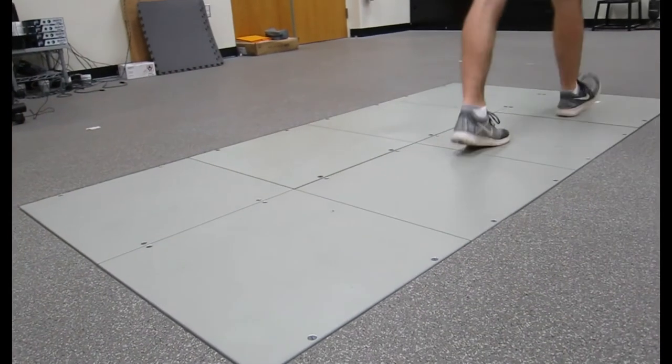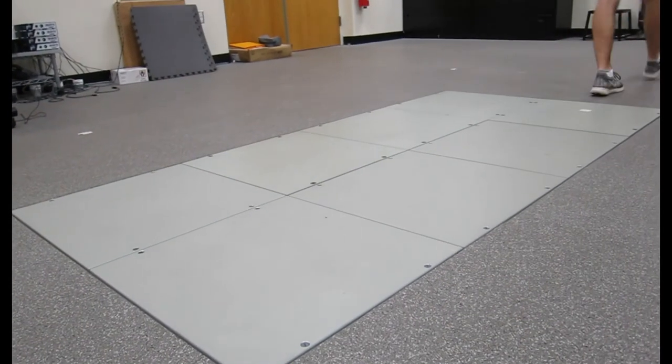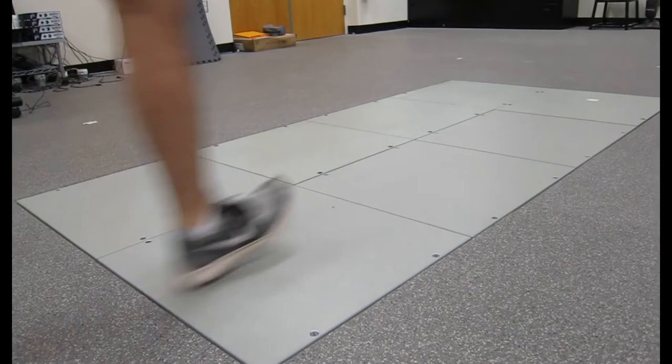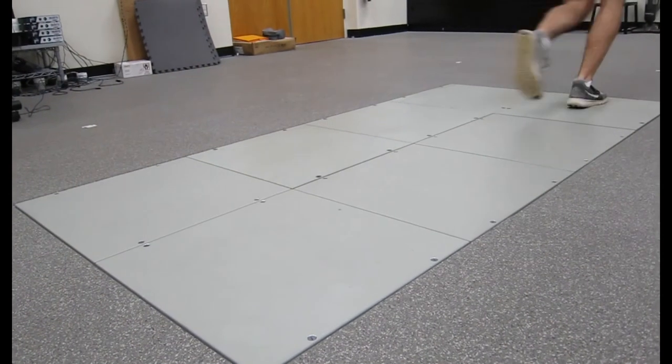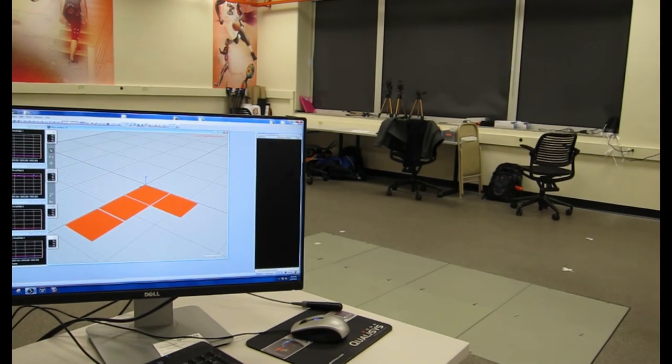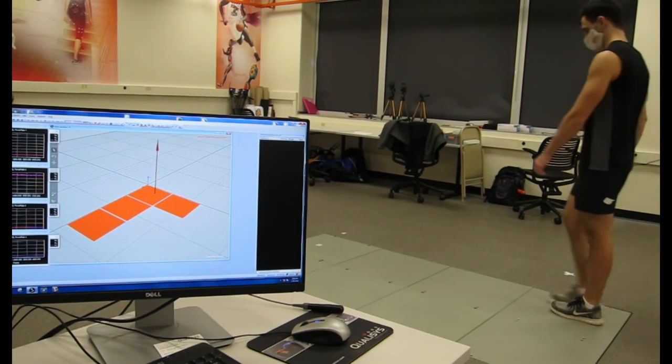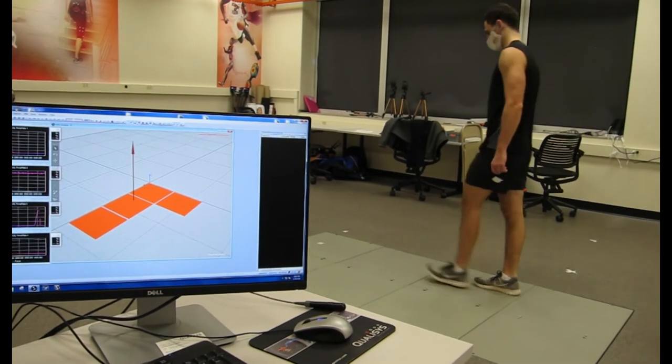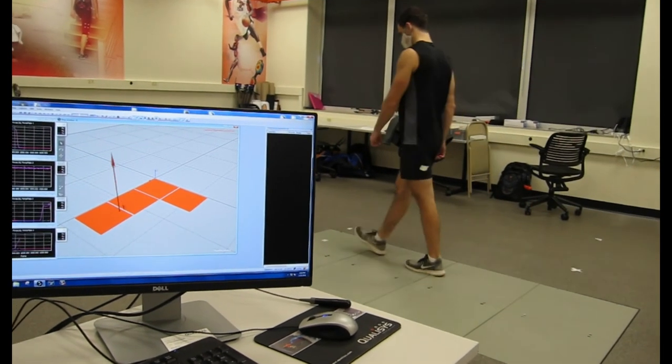If the right and the left have big differences, asymmetries can be identified, possibly related to an injury or as a sign for an injury risk.